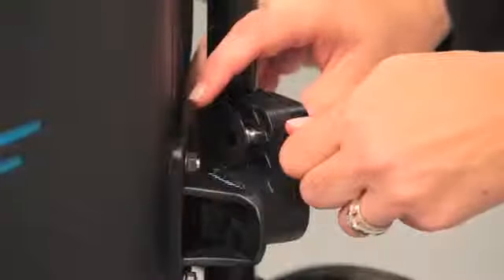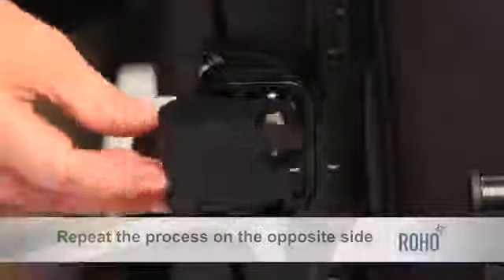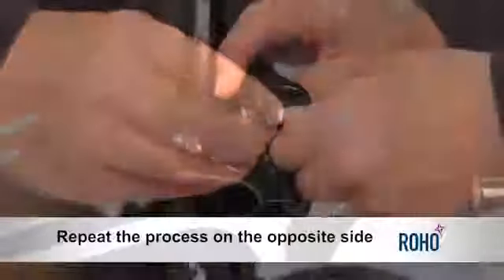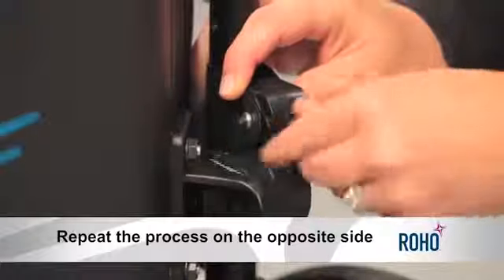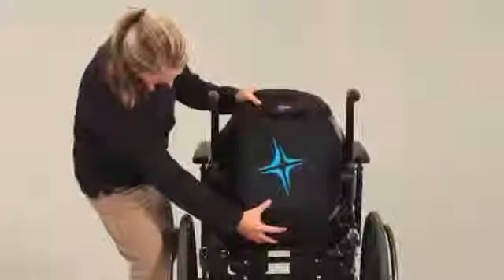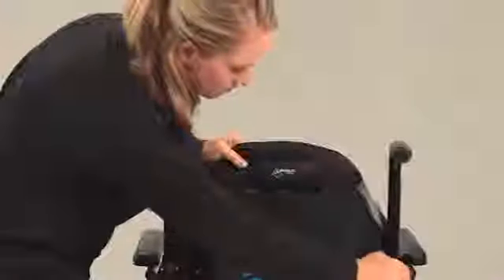Squeeze the back cane band towards the narrow end of the cane band's opening into the groove at the end of the adjustment cylinder to engage for a safe and secure fit. Using the same method, attach the hardware to the other wheelchair back cane. Then, tighten the hardware bolts on each side by hand to hold the back in place. As you attach both sides of the hardware, it may be helpful to rest the back against the wheelchair seat during installation, and then slide into position before tightening.